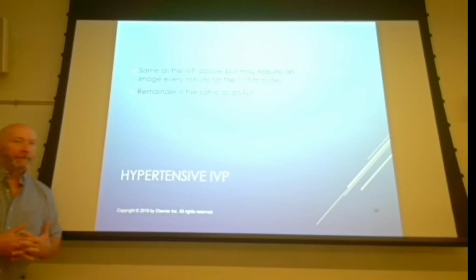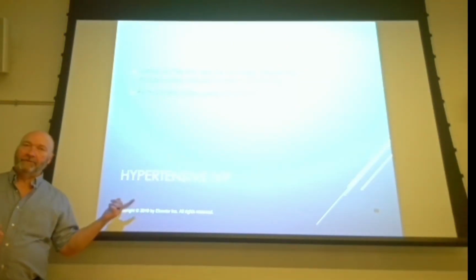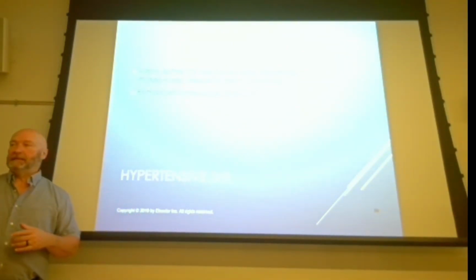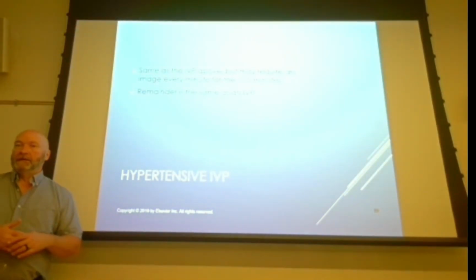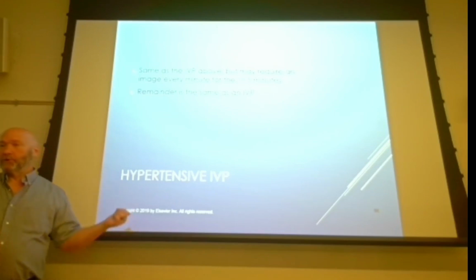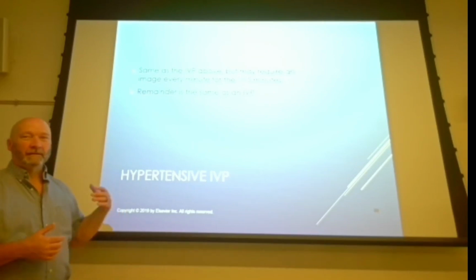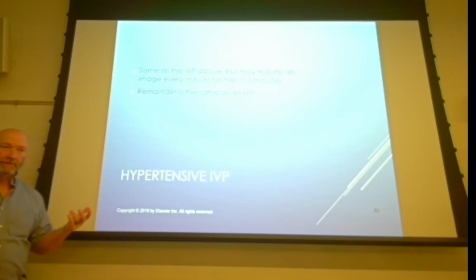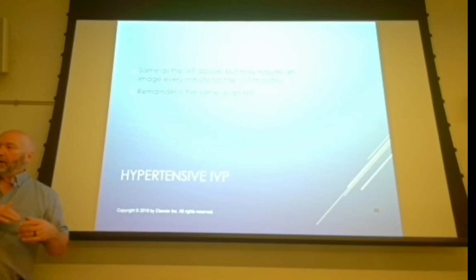We'll take a look at some images. And here's the thing. CT took over IVPs almost completely for a long time. I'm hearing that we're doing more IVPs now and fewer CTs of the urinary system, depending on patients and what their symptoms are. So for kidney stone, whatever. Some exam types are cyclical.